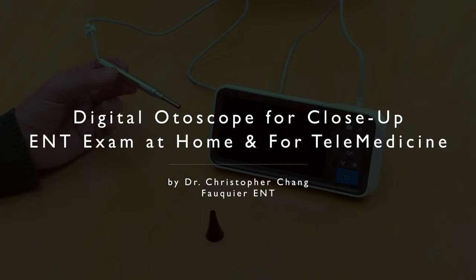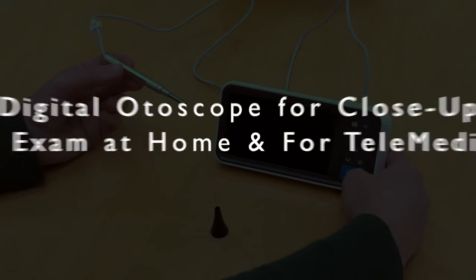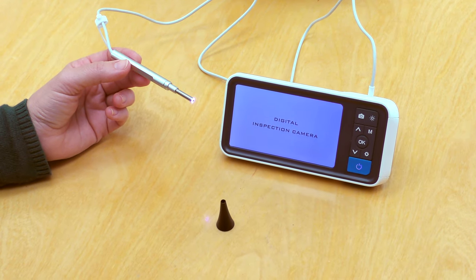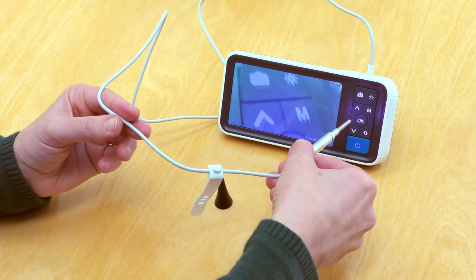Most online stores, including Amazon, sell different models of digital otoscopes that can be purchased by anybody for around $40 to $75. Depending on the model, it can come with its own monitor or a cable that can connect to a smartphone or a computer. Once turned on, the camera itself provides its own light source.